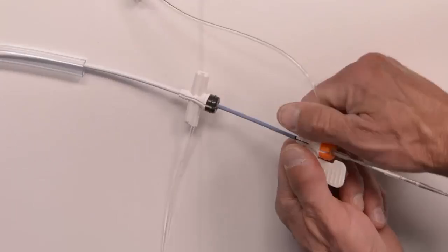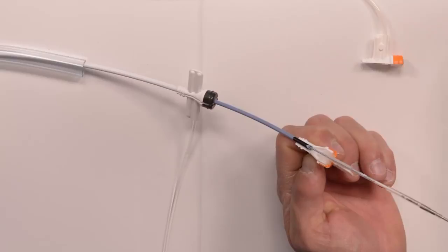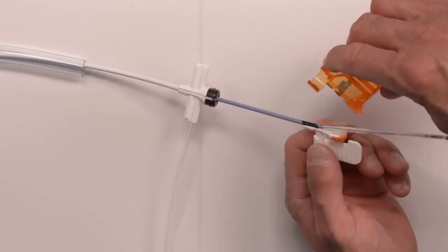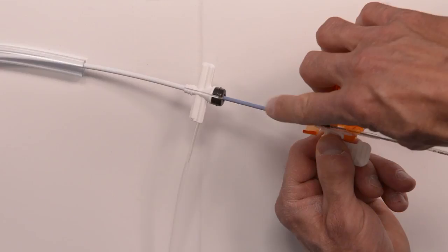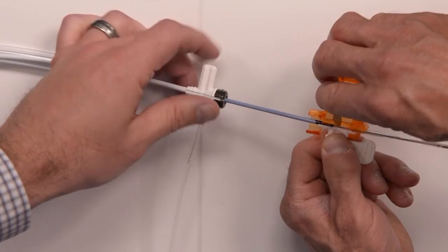The flange on the front fits right in there, and we have to engage it by putting some pressure against here. You can kind of feel it engage. I'm going to pull back with my left hand and give it a little tension to keep the LVI straight, and I'm going to have my assistant hold the hub of the CSG.